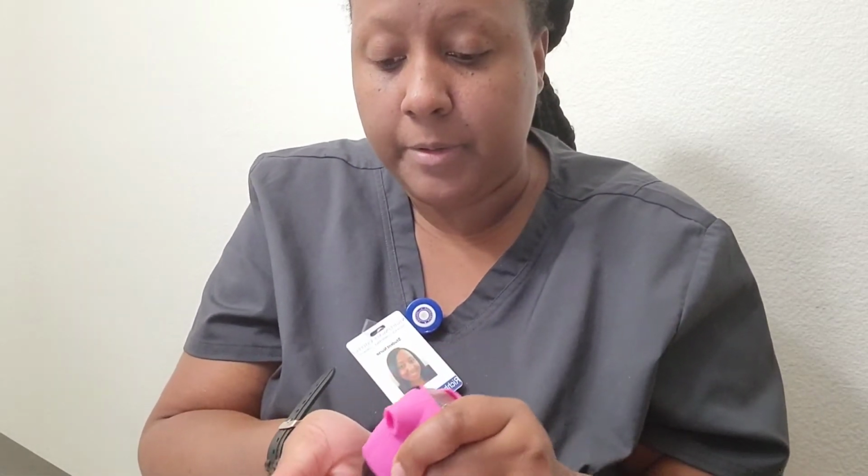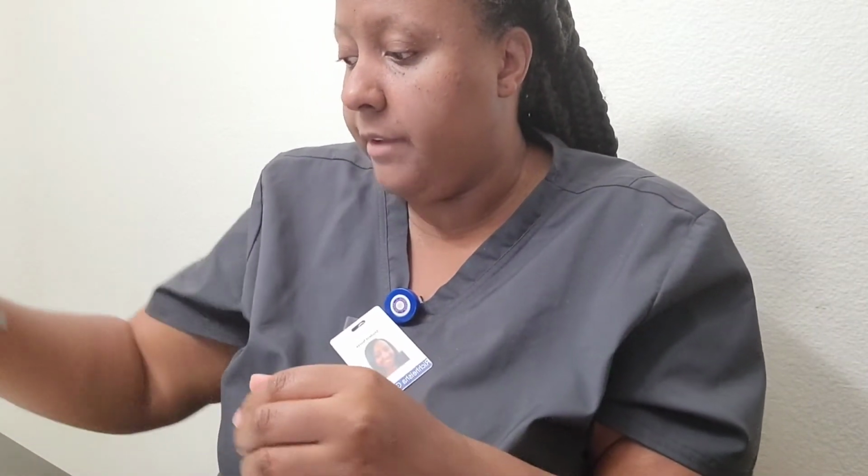I will inform the patient of the purpose, what we will be doing, and that's giving that injection that the doctor ordered. And then I will also instruct the patient to report any adverse side effects, and I will list them. And I will ask the patient, do you have any questions? No? Okay, perfect. Then I will perform hand hygiene and put on clean gloves.